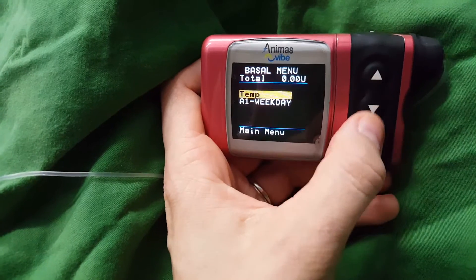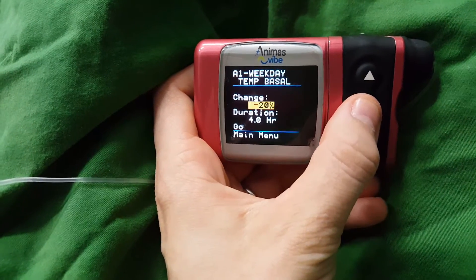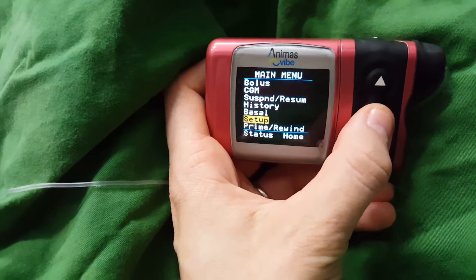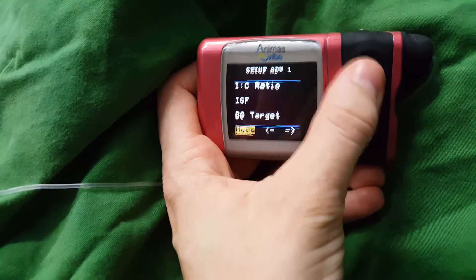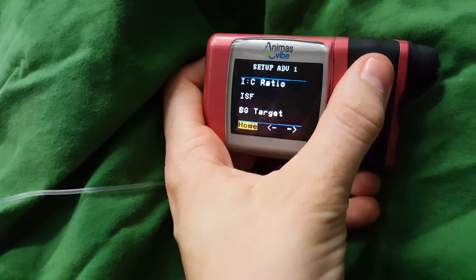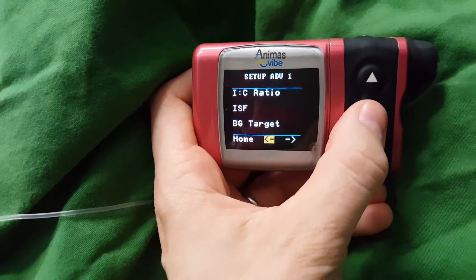In terms of your basal rates, you can also put a temporary basal on — minus 10% of the total, or plus 10%, or whatever you need. You can go all the way up to 100% and change the duration up to around 24 hours. In terms of setup, you can change the time and date. The sound and advanced settings are really handy because that's where you get your insulin to carb ratio, insulin sensitivity factor, and your blood glucose target, which you can change for different times of the day — depending on if you want to be a little bit higher overnight or whatever, depending on your individual needs.